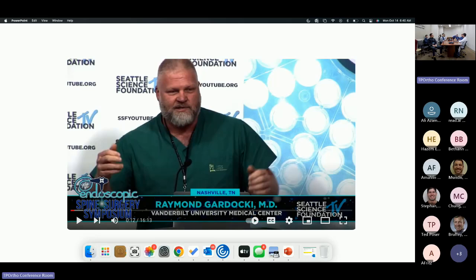It can't be somebody that you need to have a ton of lordosis, take down both sets. You're not going to do that endoscopically. It can't be somebody that, I guess it could, but if somebody needs direct decompression over the top, it's going to take a long time doing all that endoscopically. So it's a patient that basically needs a spondy reduction, probably doesn't need a direct decompression, doesn't need a ton of lordosis. It seems like a pretty narrow corridor. So that's why I think it'll always be limited.